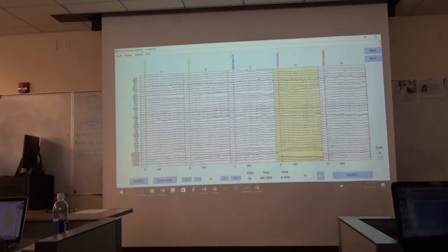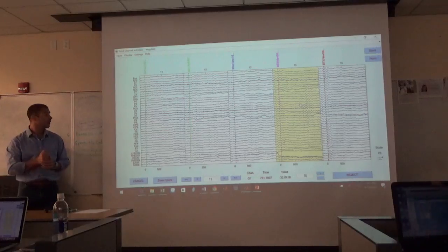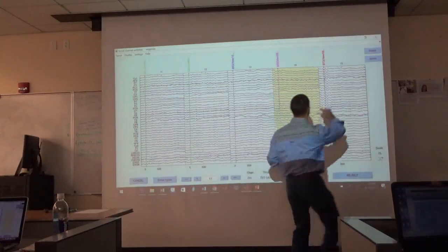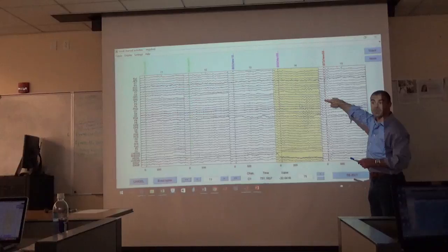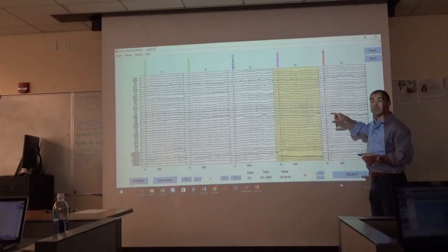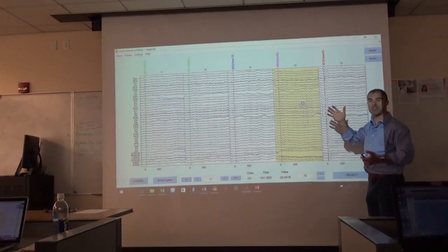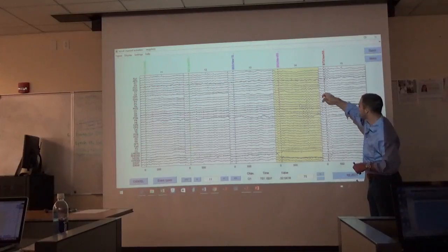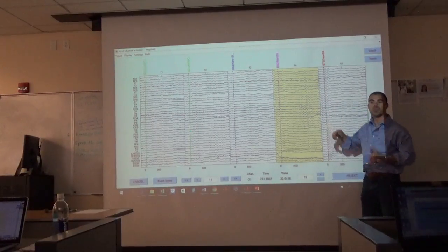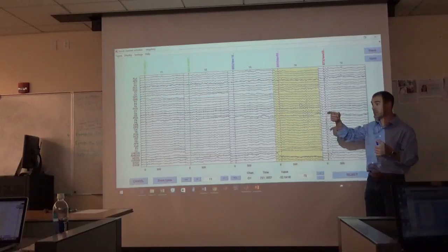Okay? And what I'll say is, we'll take this time. So remember we talked about alpha earlier today? And alpha maybe being an artifact? Or maybe not? Okay, we're looking at alpha here. See, it has all this waviness here? It almost looks like crap, right? Who remembers what crap is? Commonly recorded artifact potentials, exactly. It's an industry term. Crap. This kind of looks like crap, right? Because you want this to be kind of level and stable pre-stimulus. But this is all wavy, right? Sometimes some people might want to reject that. For us, we're not going to. But that's one example of what alpha would look like. I think you asked about alpha earlier this morning, right?